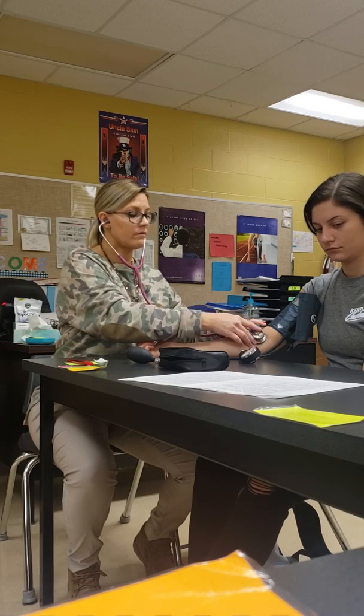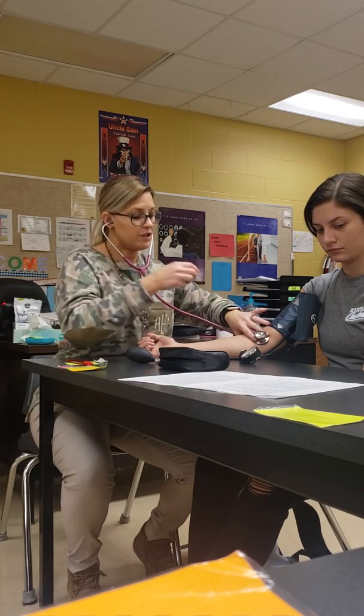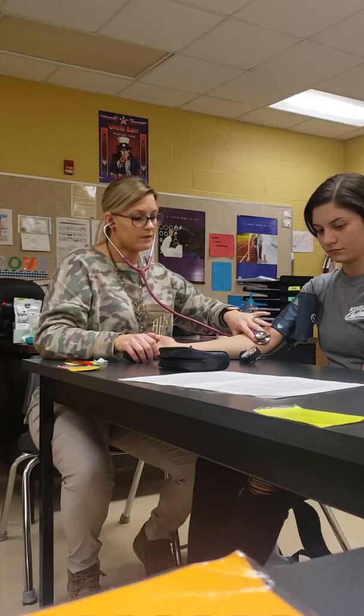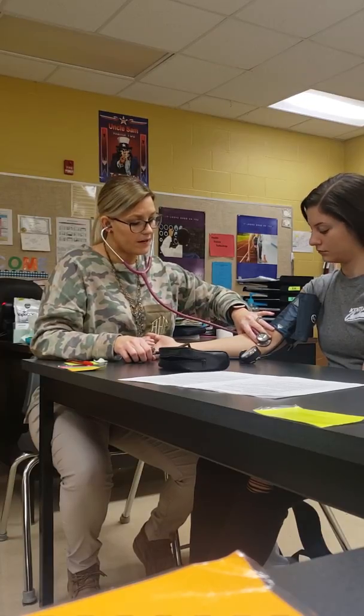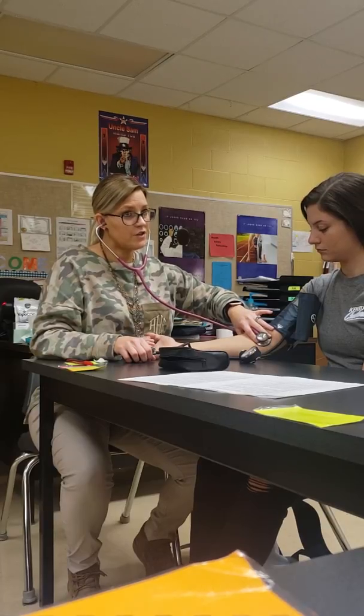All right, so I've got it on the brachial artery. Inflate the cuff. Okay, go ahead and read me the next step too, so I'm not stopping. Loosen the valve and deflate the cuff slowly, noting the systolic and diastolic reading. Okay, so how many millimeters per second do you release the blood pressure cuff? 2 to 4.